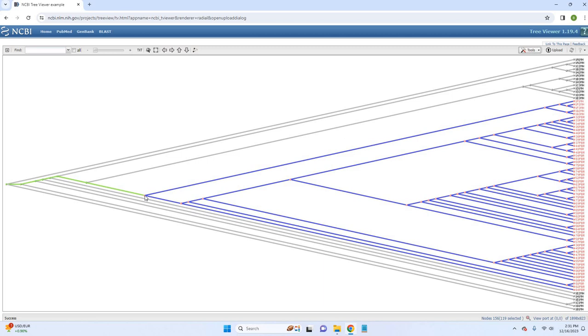So it's a different tree from a different program, but with no mix and match. Complete separation. Again, the farthest away from the base is the cancerous, the closest to the base is healthy, with healthy clustering together and cancerous clustering together.